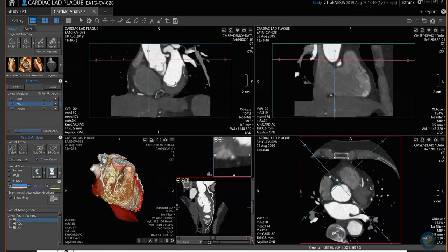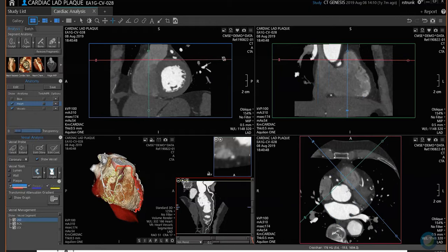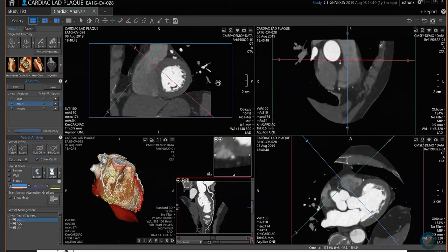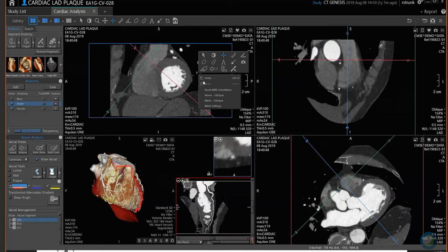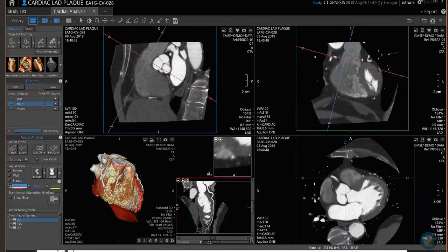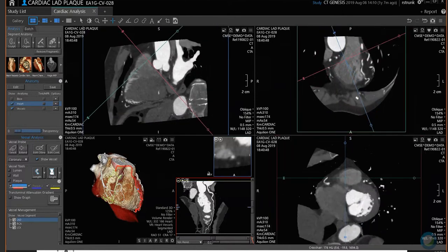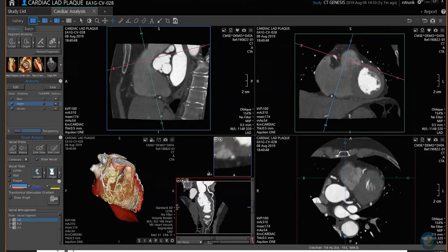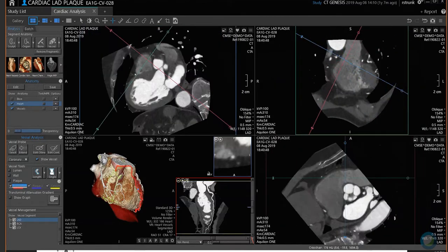Right mouse to scroll. If you have these all turned, you know, a bit skewed — if you do a right mouse click in any box, you can reset, which means it goes back to sagittal, coronal, and axial. If you move your mouse out anywhere but the crosshair, your mouse becomes a double box and that freely lets you rotate. It's something you can use to oblique your dataset.